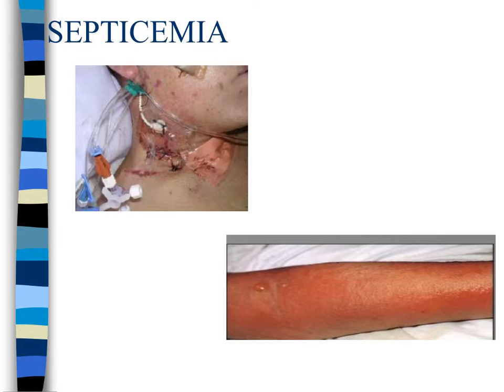We can prevent septicemia by ensuring good hand hygiene, carefully inspecting all of our IV fluids, using luer locks, covering infusion sites with appropriate dressings, following standards of practice related to rotation of sites and hang time of infusions, and using appropriate preparation.